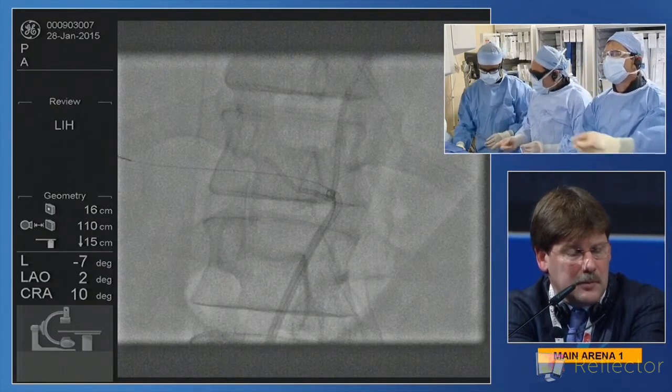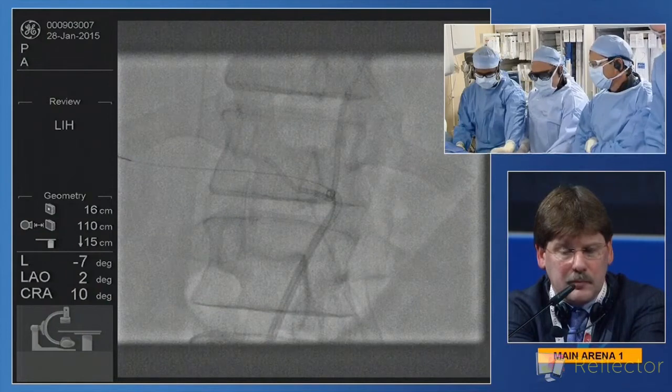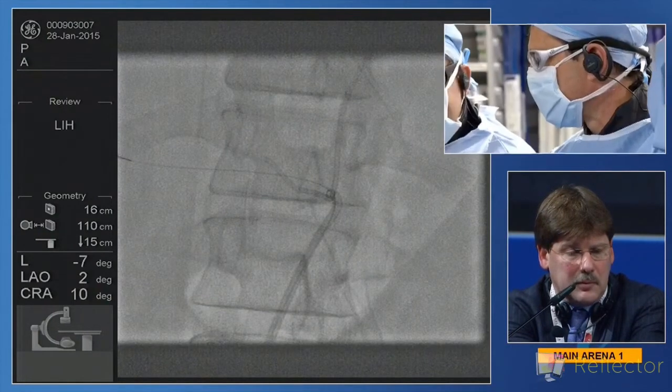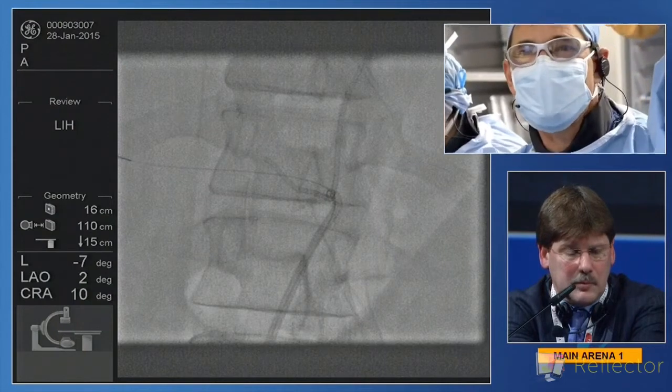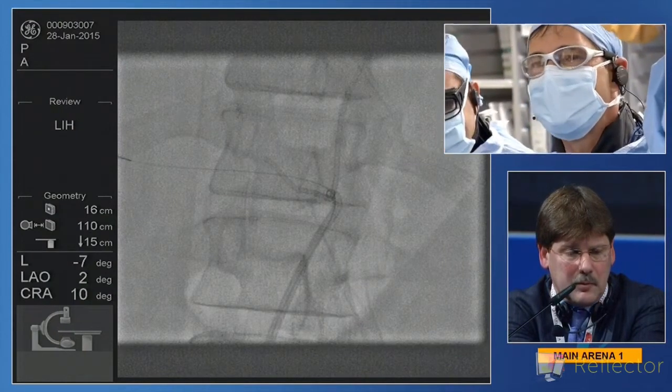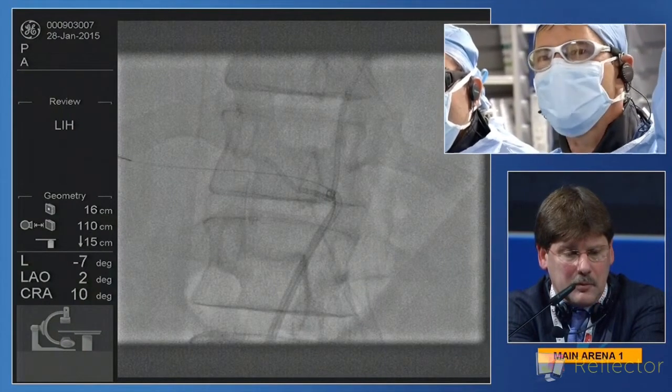That's your optimal location. We're just going to coil through here. Certainly in the trauma setting, that's what we rely on. So you reduce the pressure head and you control bleeding, say someone who has a splenic laceration, but you maintain splenic viability, almost 100%.